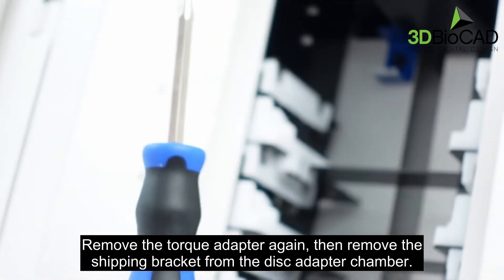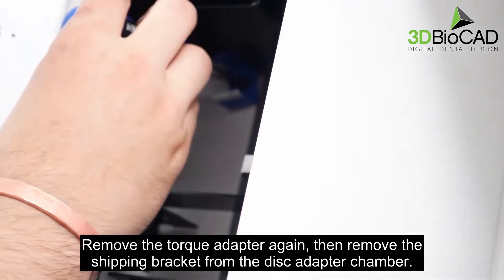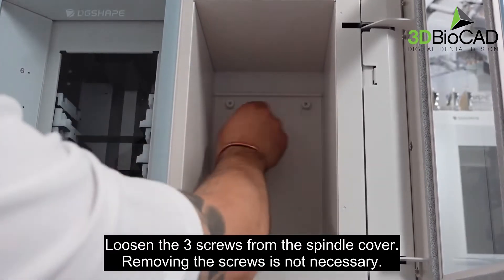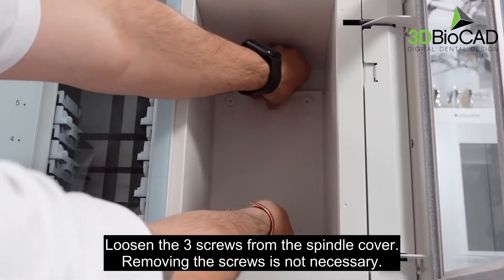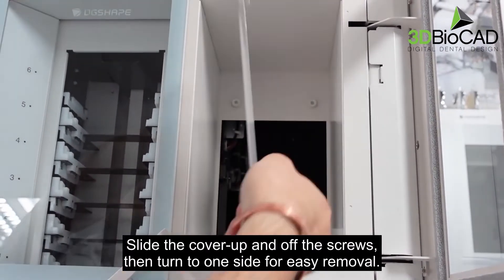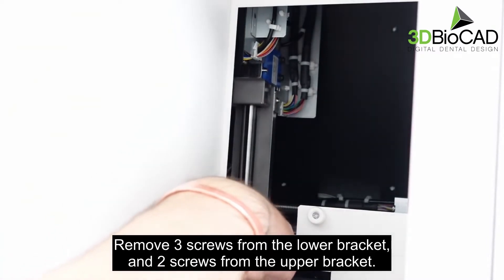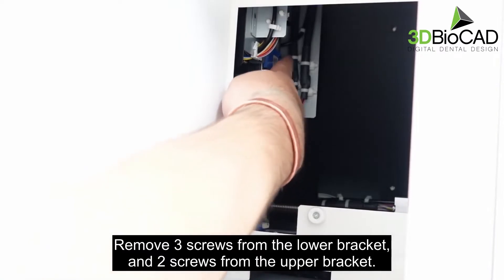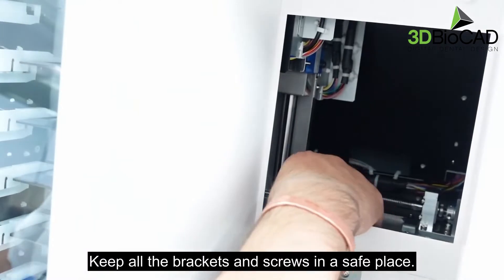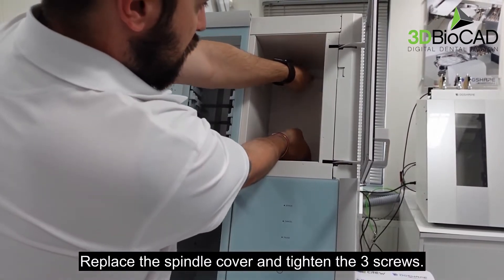Remove the torque adapter again, then remove the shipping bracket from the disk adapter chamber. Loosen the three screws from the spindle cover — removing the screws is not necessary. Slide the cover up and off the screws, then turn to one side for easy removal. Remove three screws from the lower bracket and two screws from the upper bracket. Keep all the brackets and screws in a safe place. Replace the spindle cover and tighten the three screws.